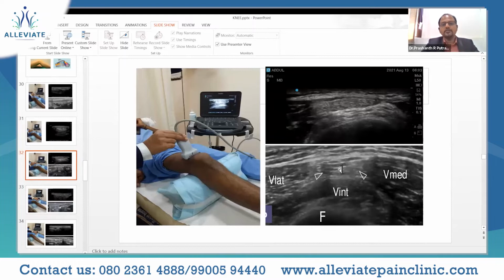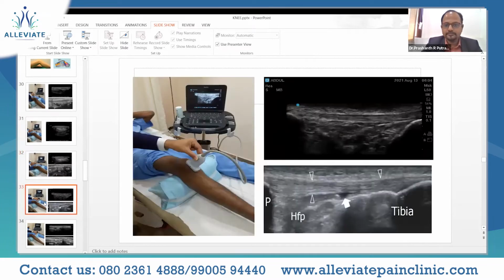All right, so this is what I was talking about. In the center, we have the vastus intermedius, and above that will be the portion of the rectus femoris, vastus medialis, vastus lateralis, and the femoral bone shadow. Please keep in mind the ergonomics while performing the scan.